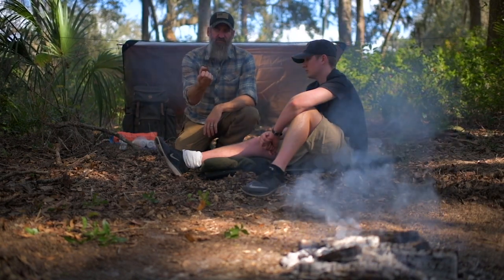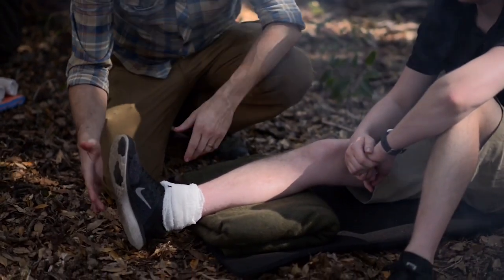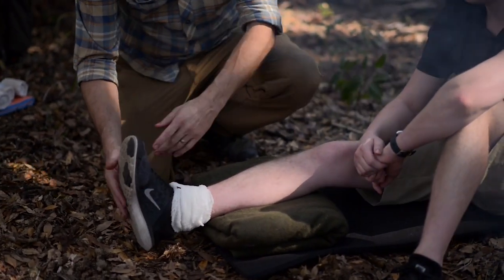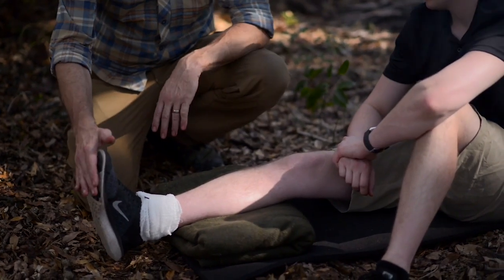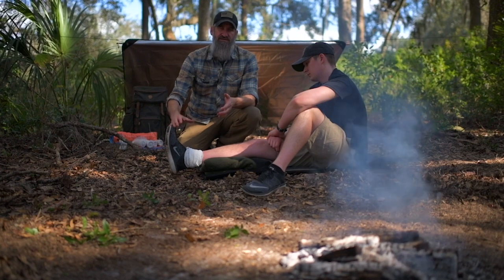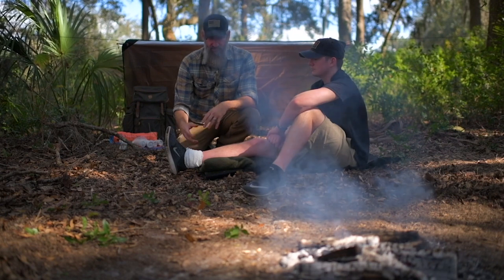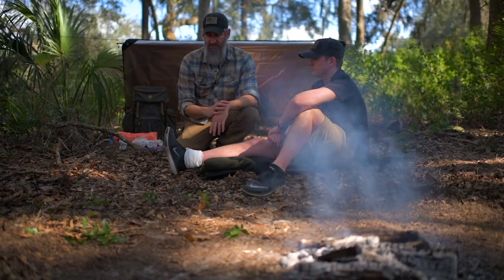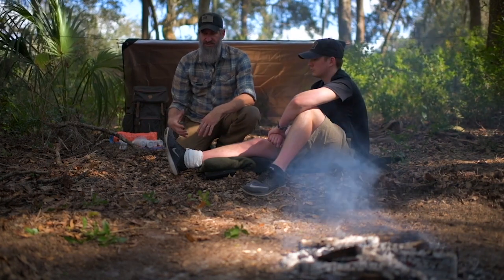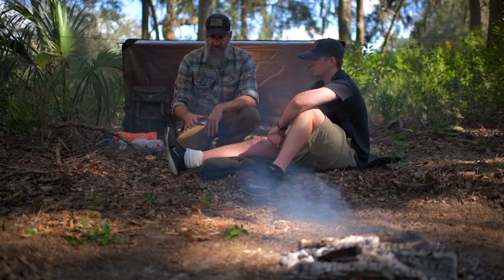The second principle is to splint in a position of function, or at least a position of comfort. The position of function for the hand is kind of a kung-fu grip. For the ankle, it's a 90-degree angle. For the knee, it's relaxed at that point. If there's no position of function, use the position of comfort — whatever is most comfortable to the person you're working on. These principles apply to working on yourself as well.